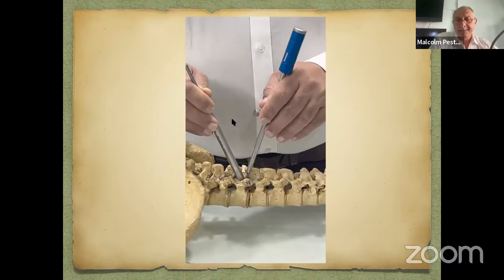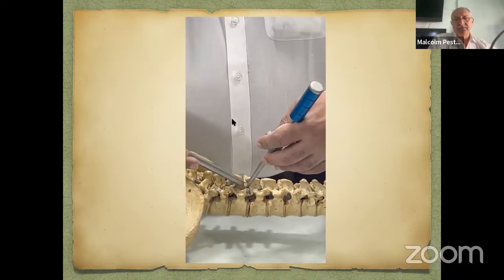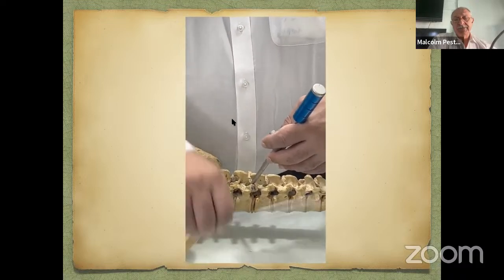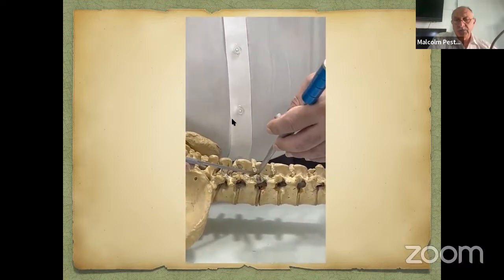Now having targeted here, my scope is on the lamina. When I turn it around, it is able to see below the spinous process. And this is the inverted U spot. The inverted U is over here. This is from where I start my burring and drilling.